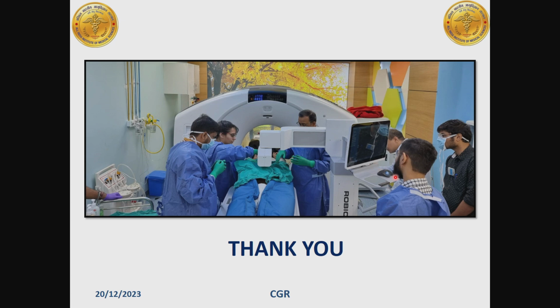Now, if I come to the CT, definitely the forefathers are the CT interventions, so there is no competition with them as such. But we need to know that there are indications which are common for both the PET CT and the ultrasound. That's why, when we are planning a procedure, the procedure first should be optimum for the patient. That is, whether the PET CT guided procedure is optimum for the patient.